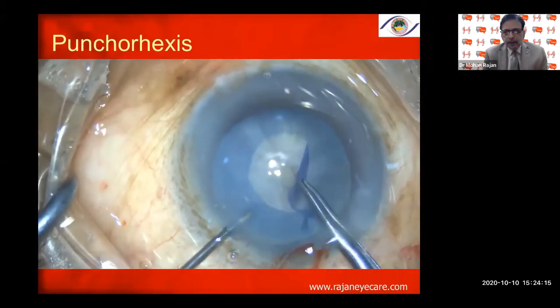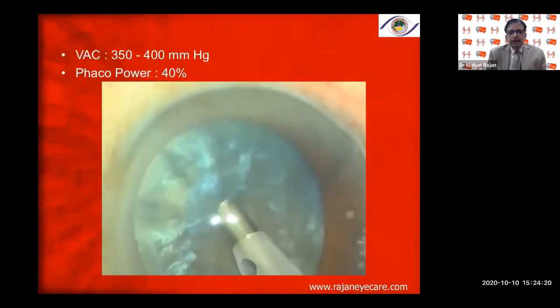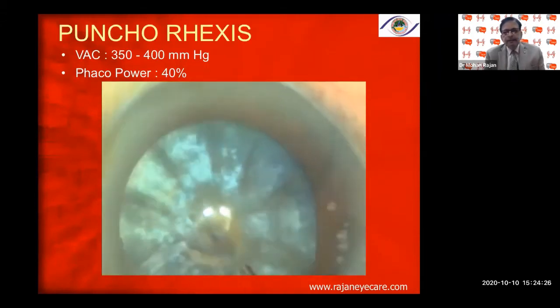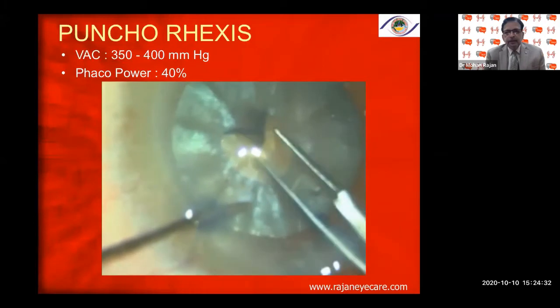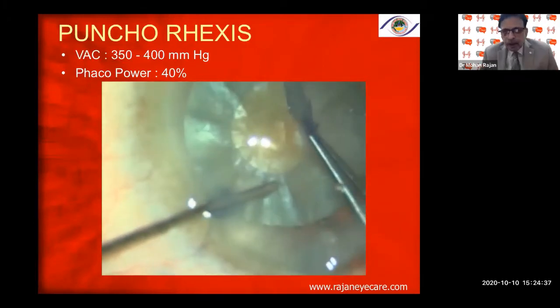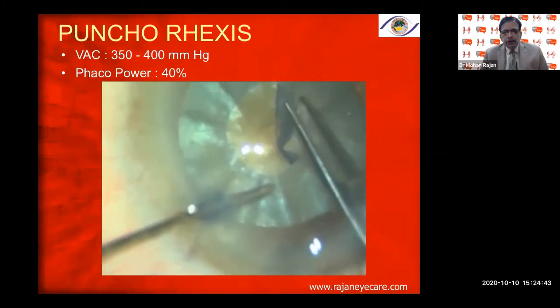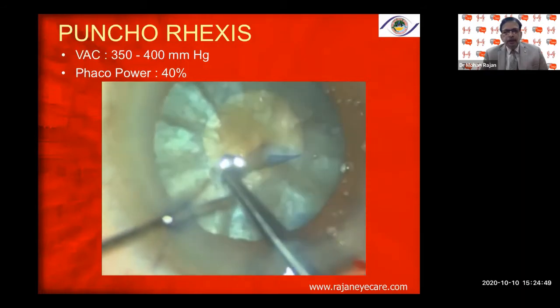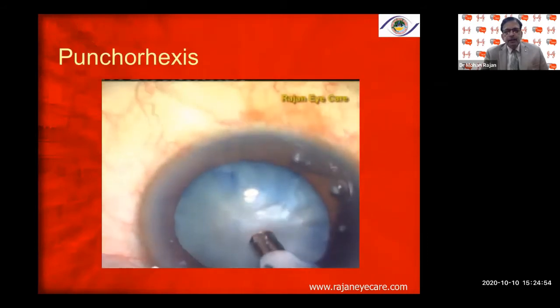With the Puncho rhexis, virtually 100% of the time you will not get the Argentina flag sign. The parameters: bevel down, simple HPMC — you don't want high-molecular-weight viscoelastic like Viscoat or Healon, as they will occlude the tip. Once you punch both the anterior capsule and go all the way down on the faco foot switch to position three, you produce faco power, debulk the nucleus, and the rest becomes very easy.